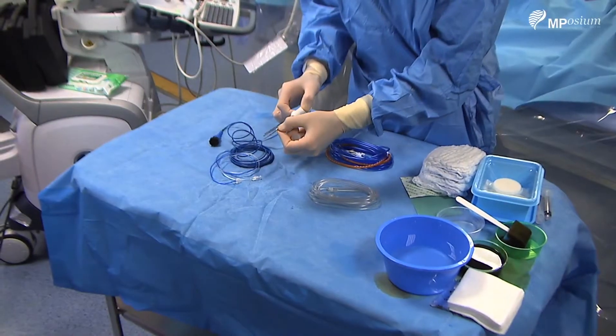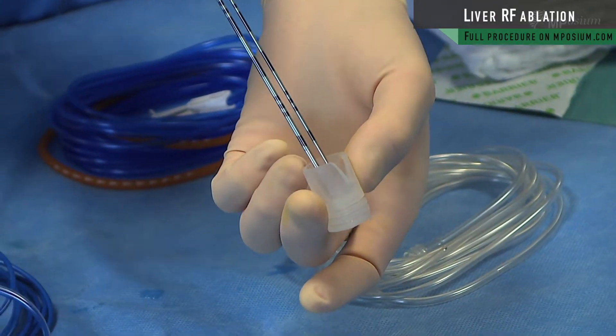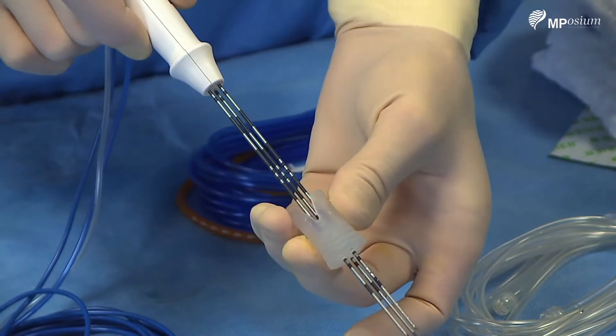I need those needles to be all together, so I will use this small applicator to place all the needles through, and it will serve as a guide to puncture.